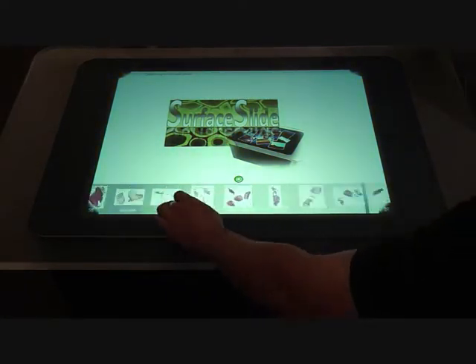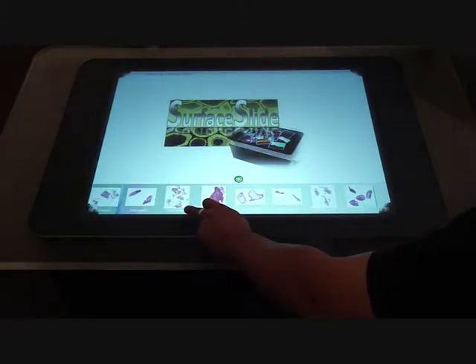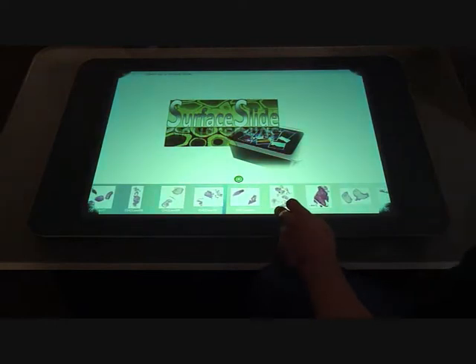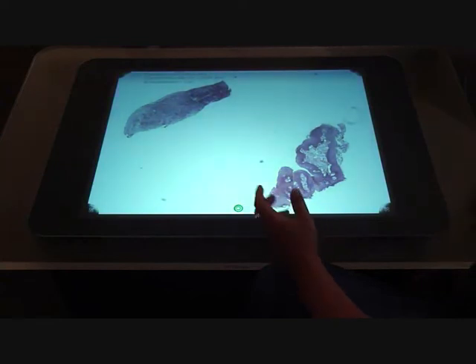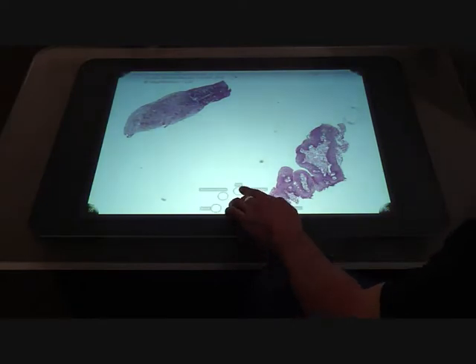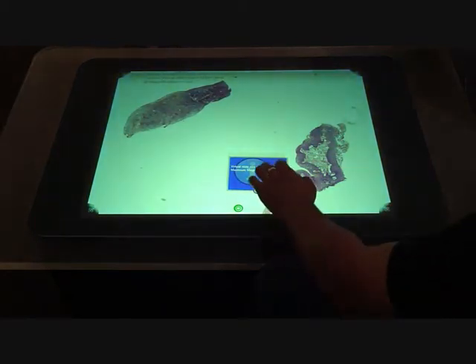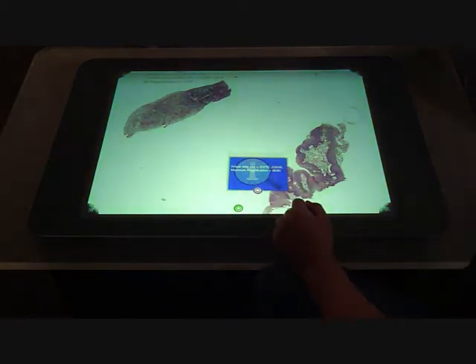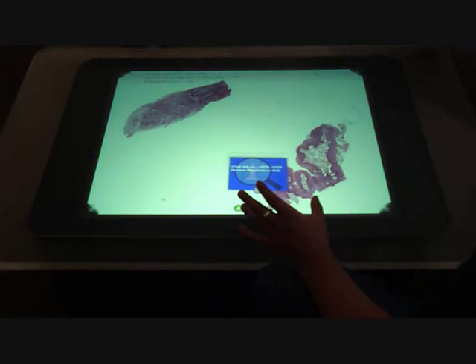Now, as you can see at the bottom of Surface Slide, there is a list of virtual slides which this user can access. If we are interested in a slide, we can drag it to the main window and it appears automatically. All of these slides are large in size — for example, this virtual slide is 26K by 21K pixels, with a maximum magnification of 40x. All of these slides are stored in a remote virtual slide server developed by iPass Diagnostics.